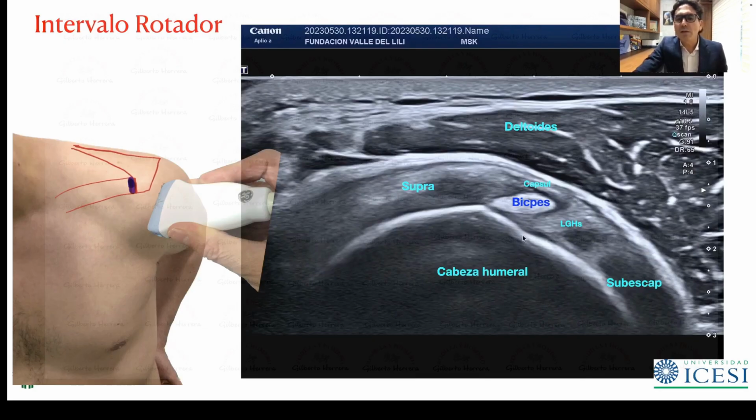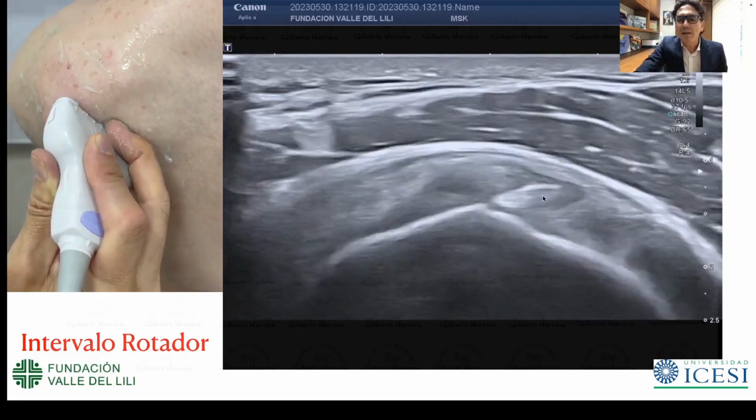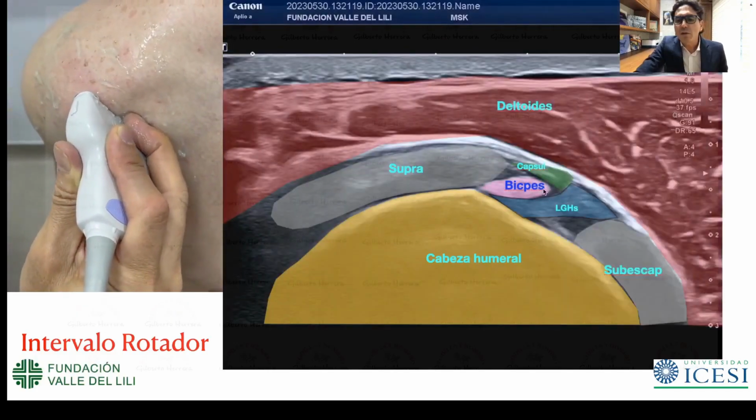Identification of the ultrasound signal. The key anatomical structure is bone, with a posterior acoustic shadow and a hyperechoic image. We will also see tissues that we have already identified, tendons, which are rich in fibers and have little water, which is why they are very hyperechoic. So knowing this and the anatomical segment, let's do the ultrasound.